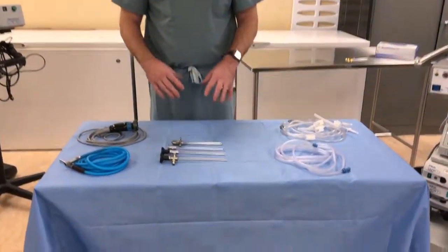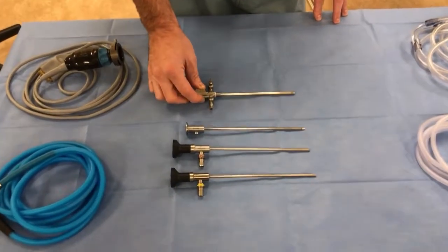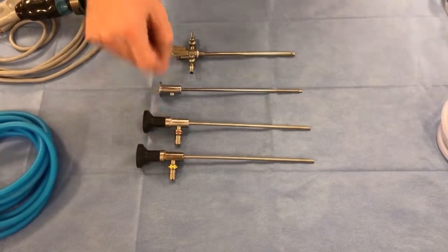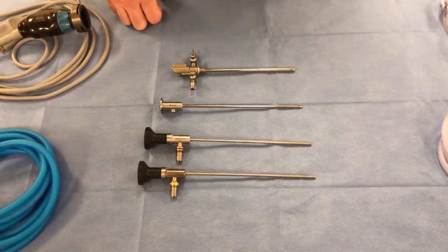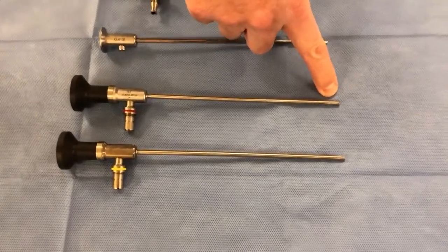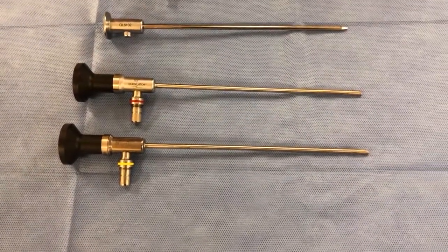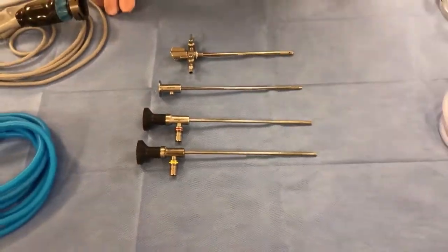First we'll talk about the different equipment. This is our arthroscopic sheath. This is a trocar. These are the arthroscopes — there's a 30 degree and a 70 degree arthroscope, the most common ones used in large joint arthroscopy. The 30 or 70 degree designation is dictated by the bevel on the end of the arthroscope. With a 30 degree scope you're looking at a 30 degree angle out the front, and with a 70 degree scope you're looking at a 70 degree angle, which increases your overall potential field of view during arthroscopic surgery.